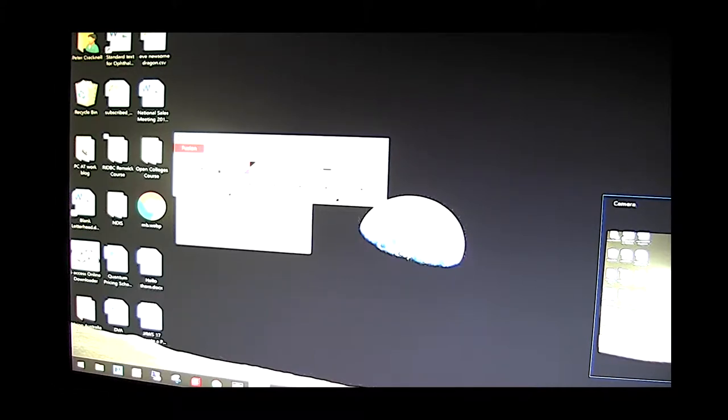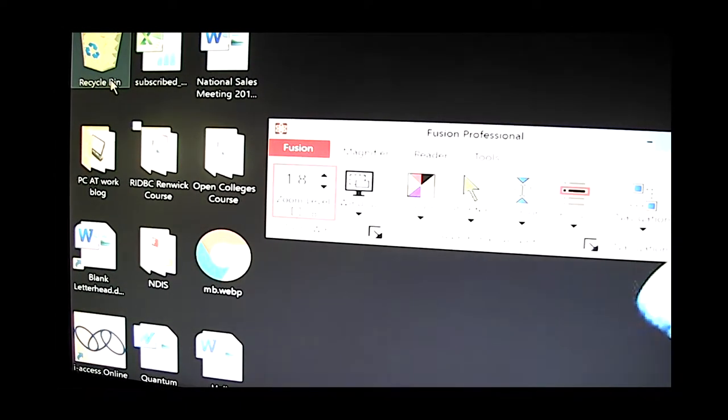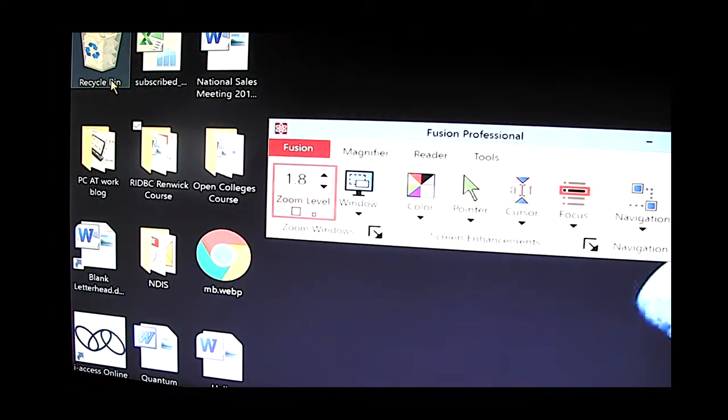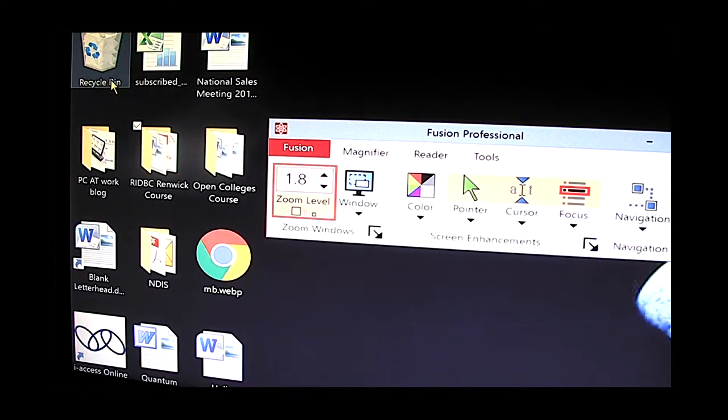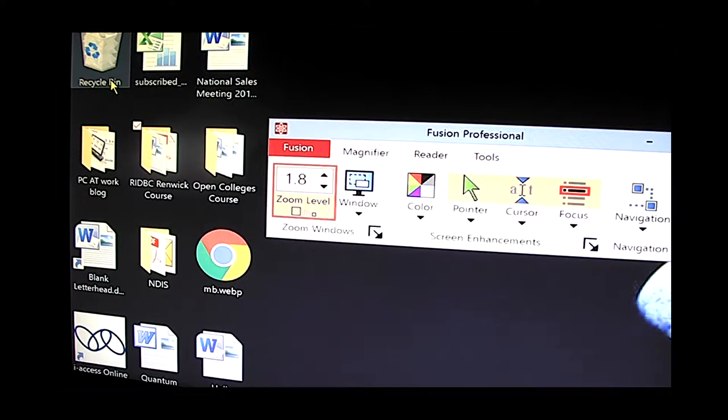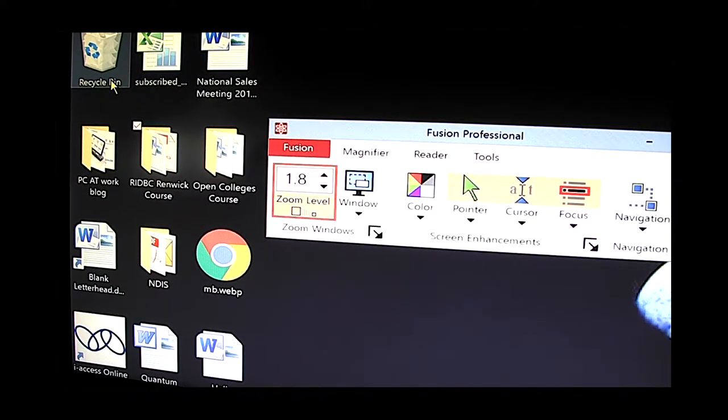So to increase the magnification I could just use the mouse pointer and click on the zoom controls. And now you'll see that you'll also hear it speaking in the background. That's the Fusion JAWS speaking in the background there.